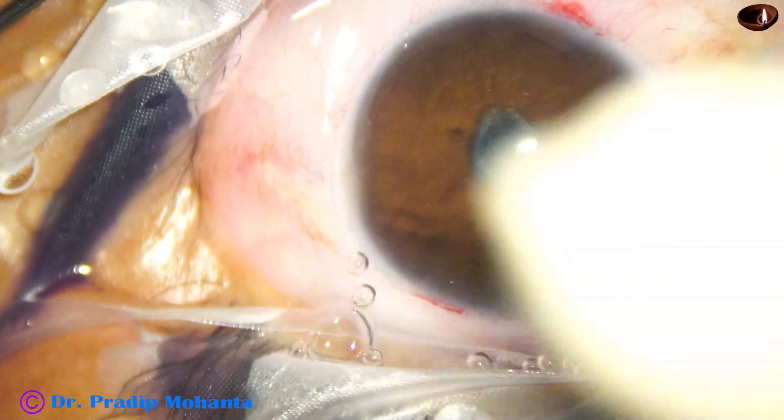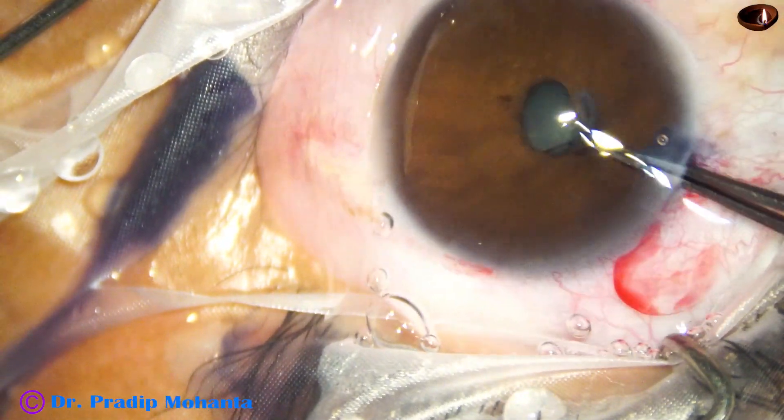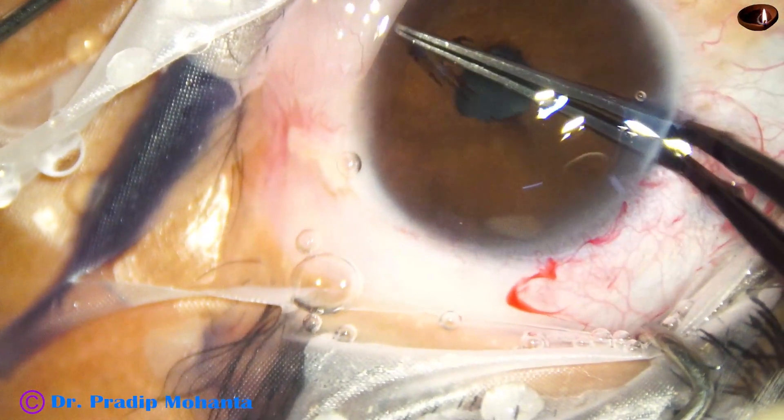Then I take the capsulorhexis forceps, hold this membrane and pull it — and it comes out. Nicely it came out.